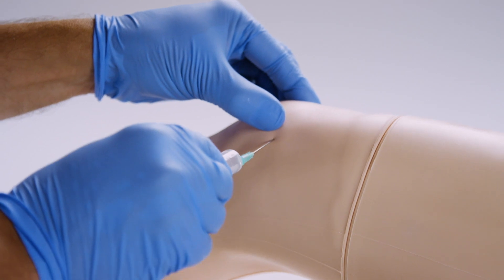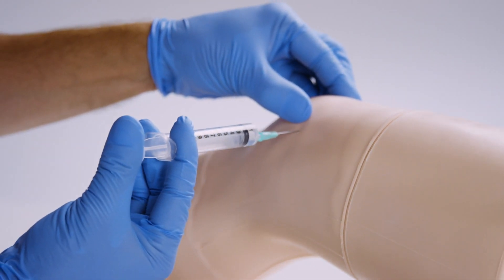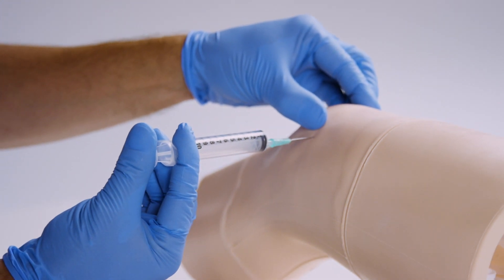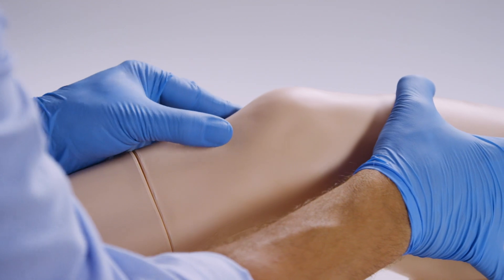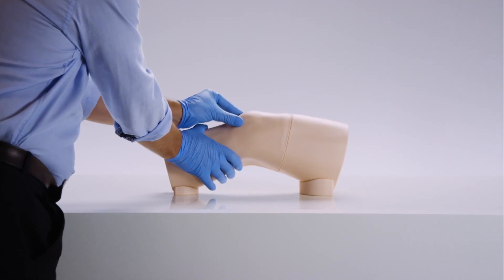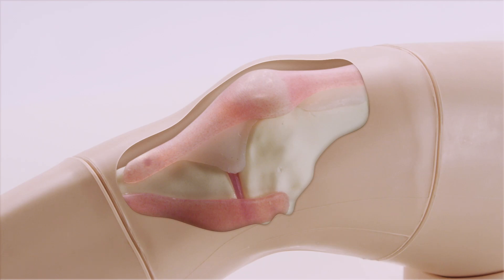Suitable for both blind or ultrasound guided methods, allowing trainees to develop their skills and confidence. Realistic to touch, it includes synthetic soft tissue and bony landmarks. Beneath the skin lies accurate internal anatomy and a palpable patella.